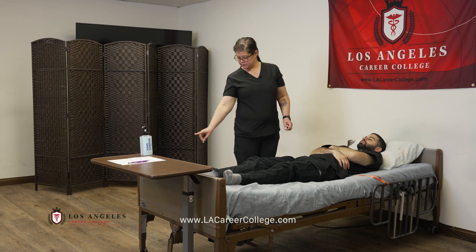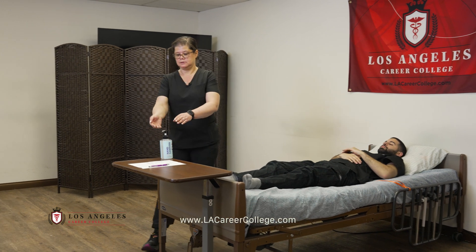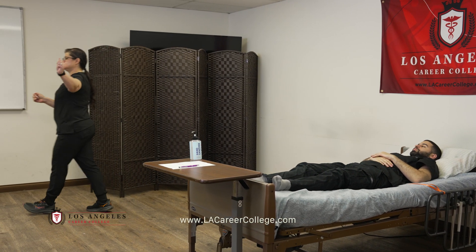Is there anything else I can do for you? The bed is low, the wheels are still locked, and your call light is within reach. Sanitize hands and provide privacy. Skill complete.